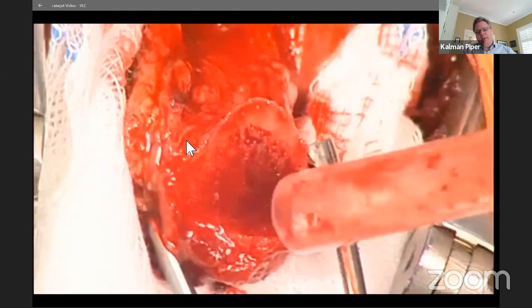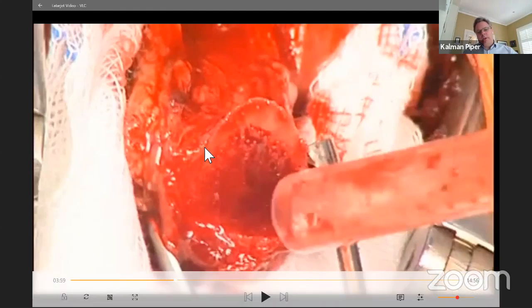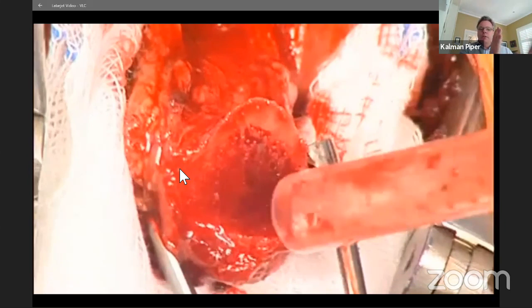But my teaching in France was to, in fact, place the undersurface of the coracoid against the glenoid neck, and the lateral part of the coracoid graft will be facing the same way as the joint surface. Because my teaching has been the broader surface attaching to the glenoid neck increases your union rate, and the bone facing the articular side doesn't need to be congruent or even level with the articular surface. It's actually acting as a bone block. It's not actually trying to recreate some of the joint surface.